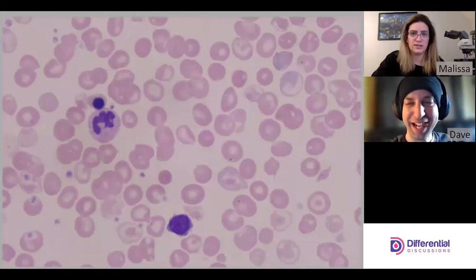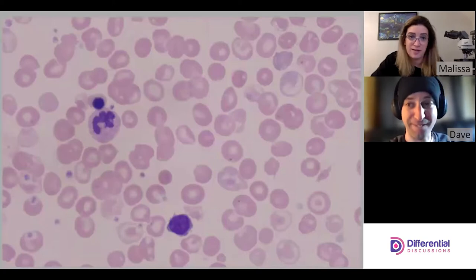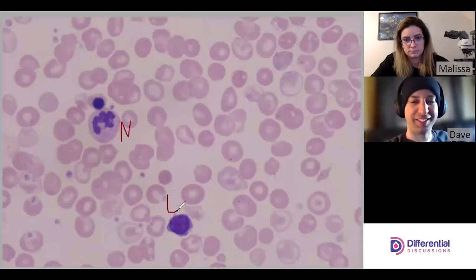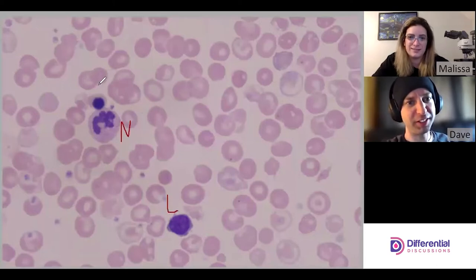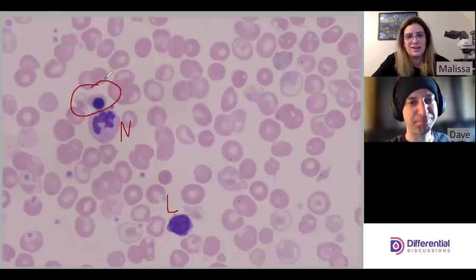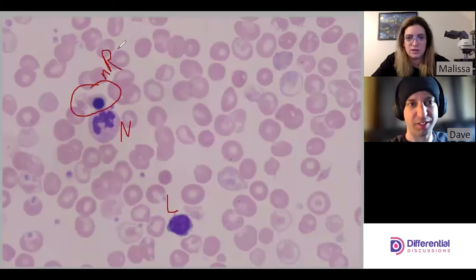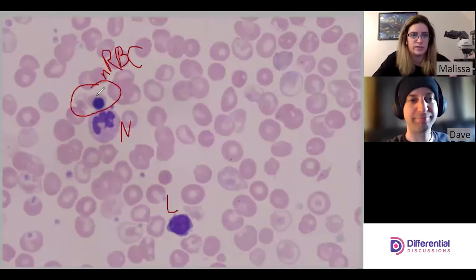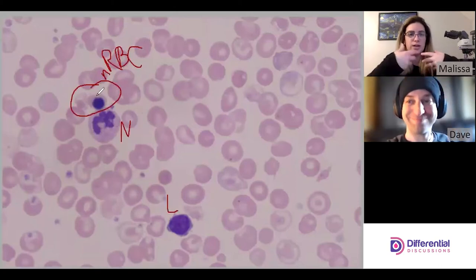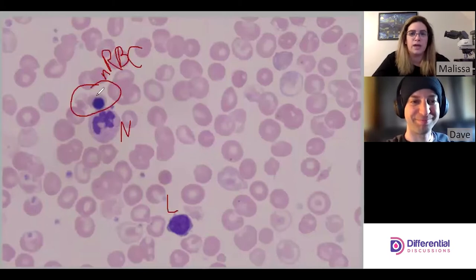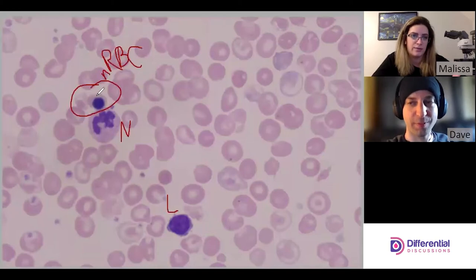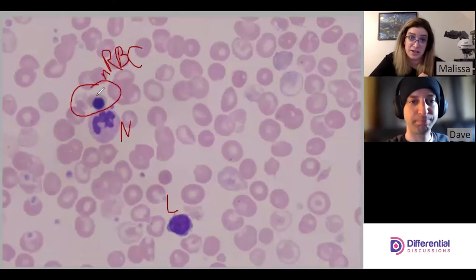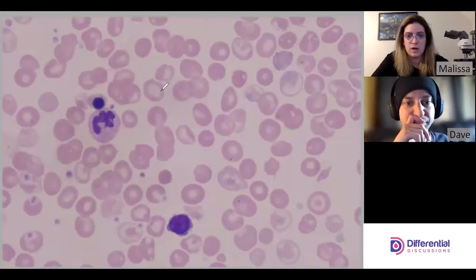Before we get to the red cells, let's talk about the nucleated cells in the field because we don't just have white cells. We have a neutrophil, a normal lymph, and then there's one fella who's nucleated and doesn't look like the others — an NRBC, a nucleated red. His cytoplasm looks very similar to the mature erythrocytes around it, so we know it's at the orthochromic stage, getting ready to spit out that nucleus. This is the most common NRBC we see under marrow stress.